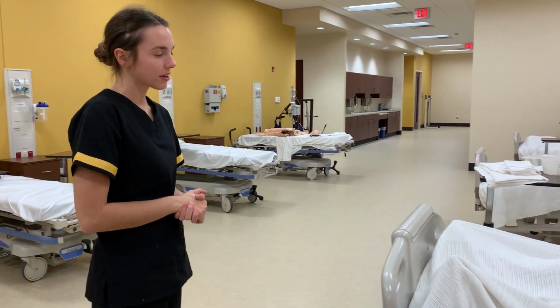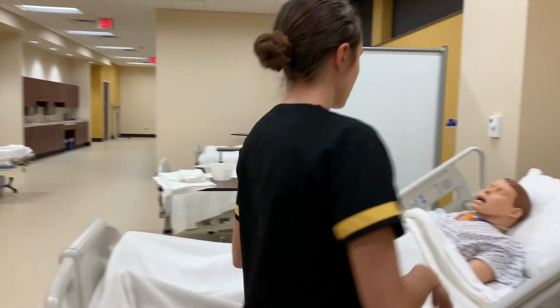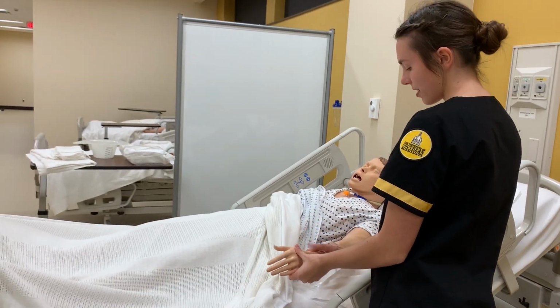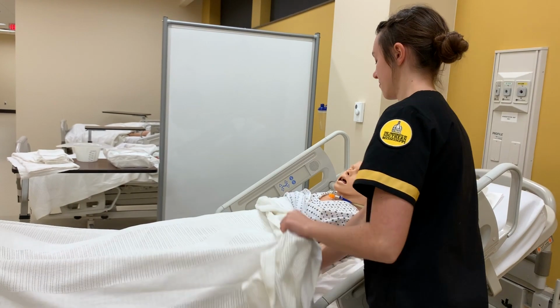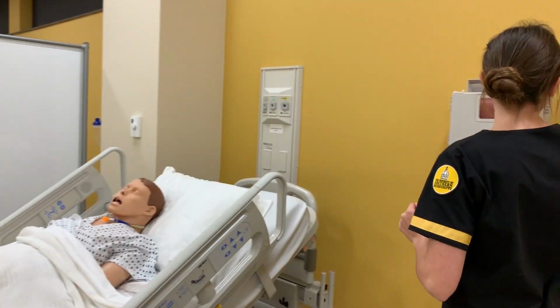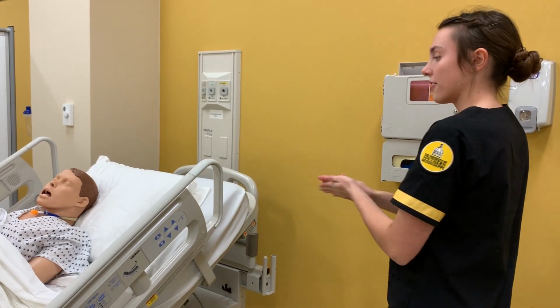My name is Breana, and I'm going to be your nurse for today. Real quick, I'm going to look at your armband. Can you verify your name and date of birth for me? Okay, perfect, Mr. Benjamin. So we are going to be inserting a catheter today.